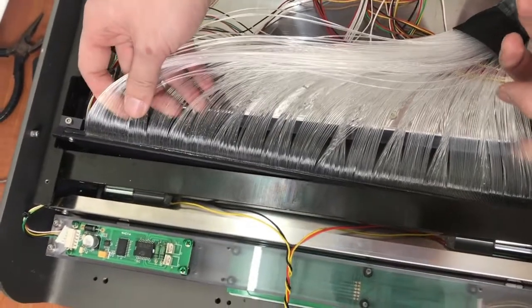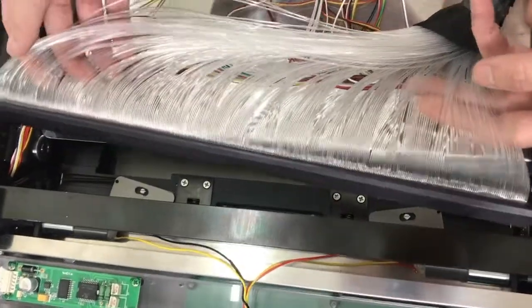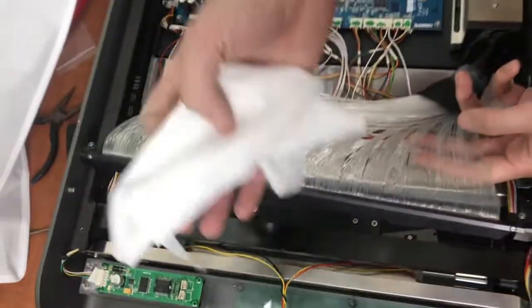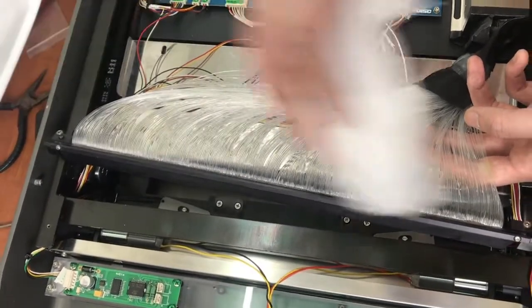Be aware of these cables. After that, you can see there is the fiber bundle. Prepare the cloth that you need for the cleaning of this area.